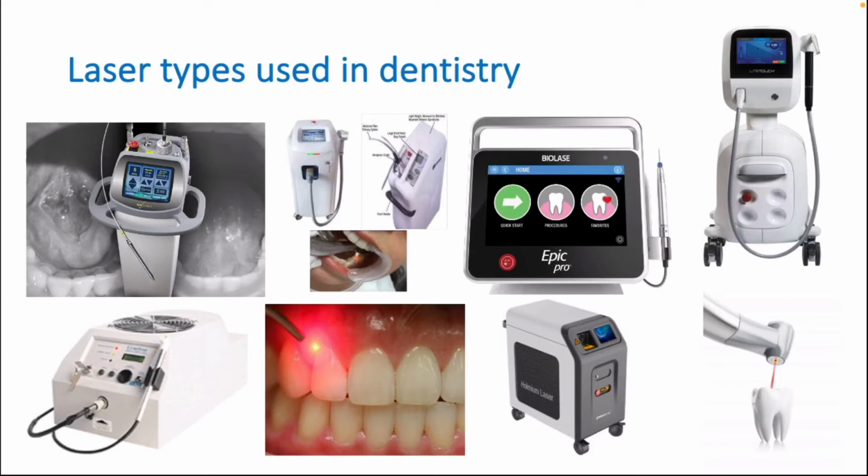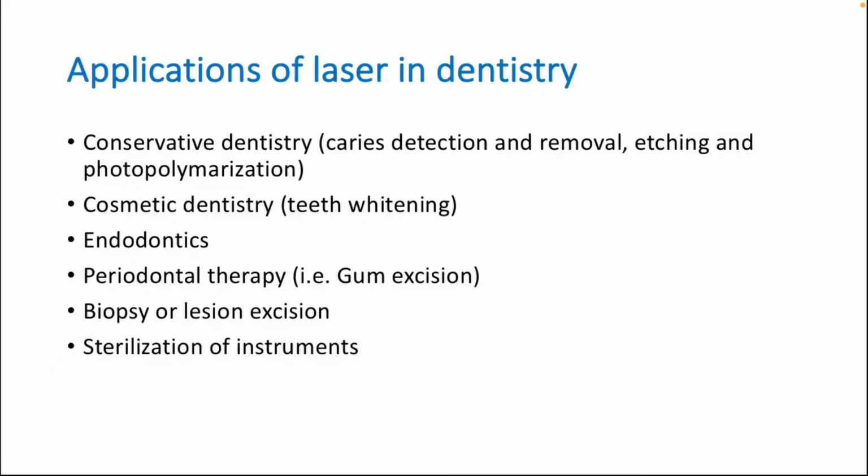Second one is the neodymium YAG laser, which is frequently used in bone and cartilage ablation. Others include holmium YAG lasers, erbium YAG laser, argon, diode, excimer laser, and so on and so forth. Applications of laser in dentistry. Laser has many indications in medicine, like optics, treatment of vascular lesions, and laser hair removal, and so on. But in the dental specialty, laser has weaved its way into several dental branches, including conservative dentistry, cosmetic dentistry, endodontics, periodontal therapy, biopsy, and sterilization of instruments.